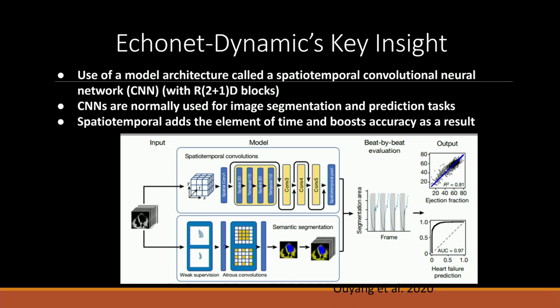And so what we do with the spatial-temporal convolutional network is we add in these convolutional layers called temporal convolutional layers. This is useful because when you incorporate temporal layers, you're encoding patterns that connect spatial features over time. So you're identifying how different parts of a frame, like in the heart, are changing, and as a result, it's better for prediction of things like EF, which are inherently time dependent.